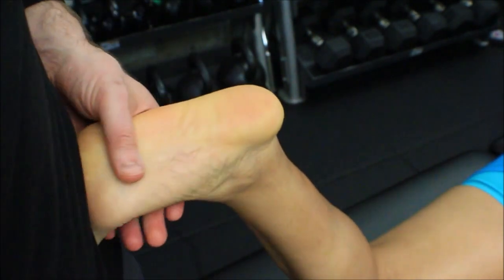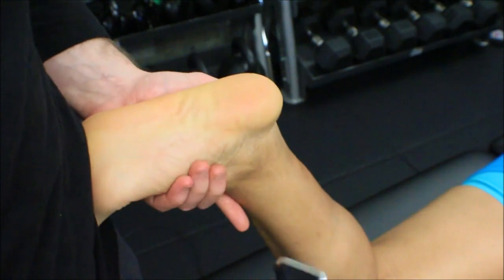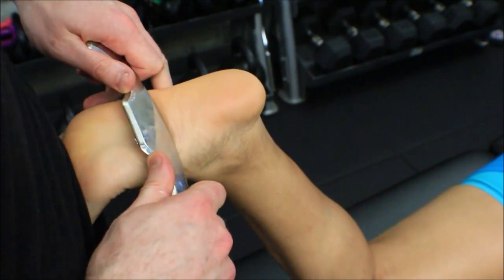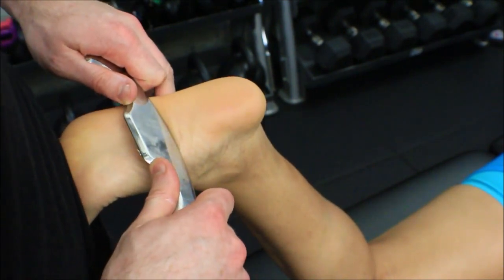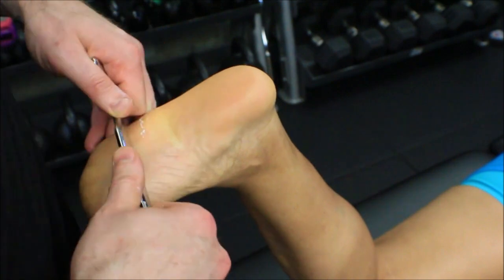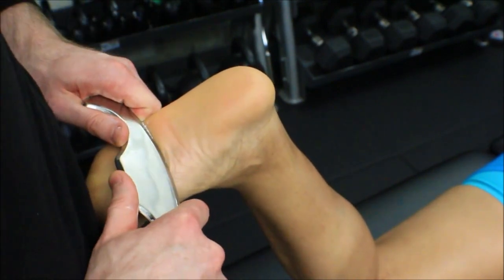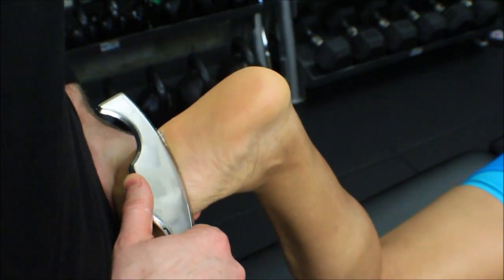And then it would be really hard to show you guys in this position how I would do the pin and stretch technique. You guys saw a better view of that in the full body view. But just remember, all you're doing is starting this way, pinning down some tissue, going to your 30-degree angle, and then go ahead and dorsiflex for me, Sonia. Then having her pull her foot down and her toes up. And then of course you could add overpressure. So you're pinning down this way, and you guys can see the depth that I'm getting into the tissue there with the tool, and you'd continue to push through.